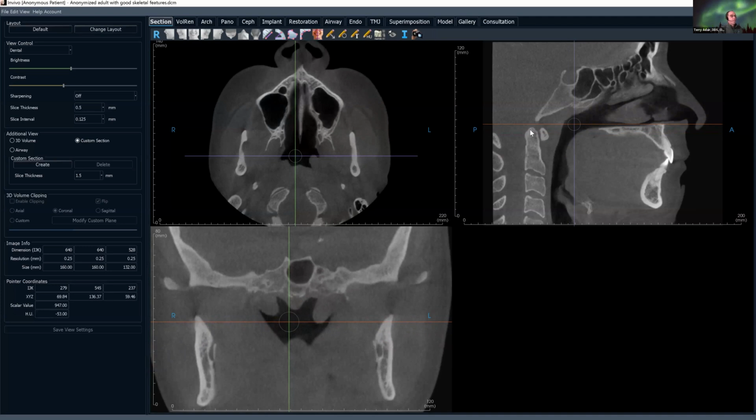Then I glance in sagittal. I look at the relationship here from odontoid to basion right here to see if there's a space, to make sure that this is not impinging or intruding into foramen magnum, which is anatomically important. So we see C1, C2.